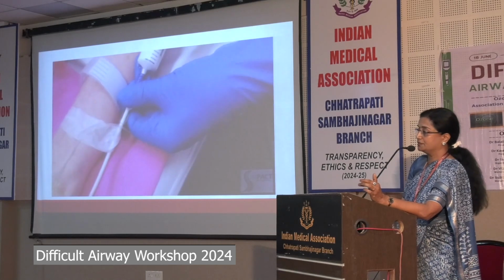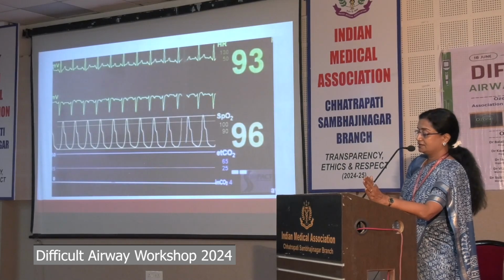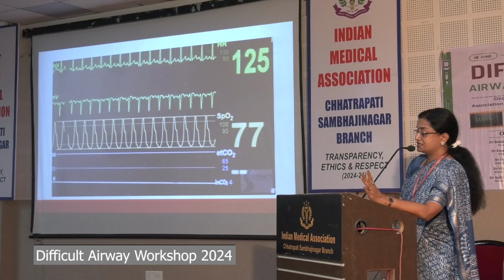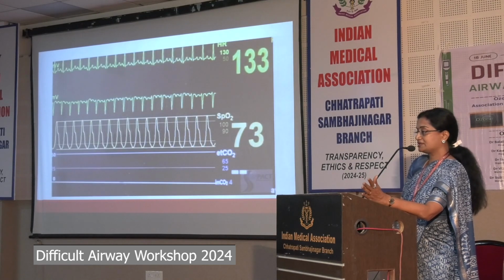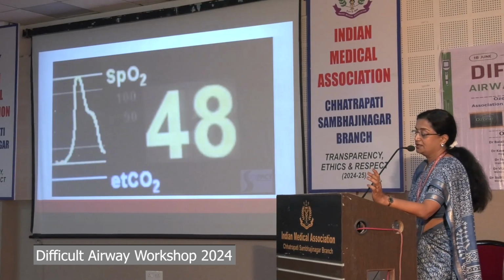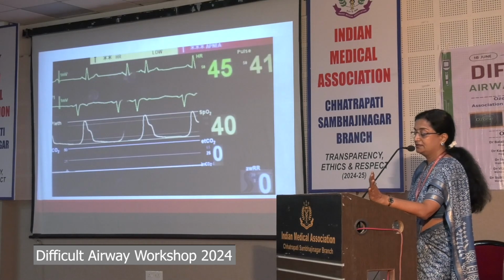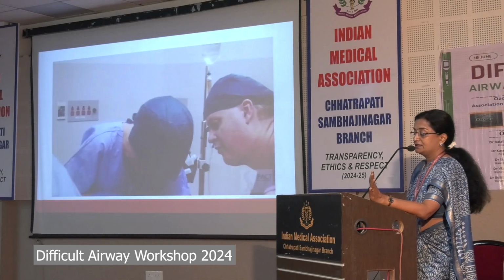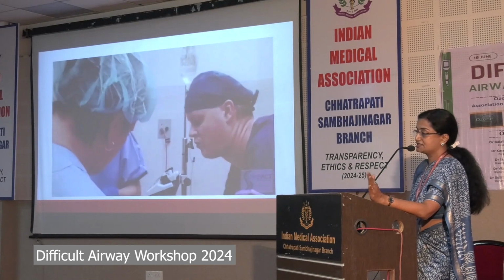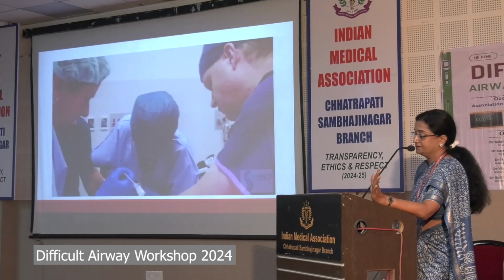This is the case of Elaine Bromley. She had come for a simple ENT case. See, there is no pre-oxygenation. The saturation is falling. She directly went for the SGD. Saturation keeps falling. No call for help. Nothing is ready. Still, she is only attempting. There is trauma caused. There is an ENT surgeon in the premises, but he is not called.